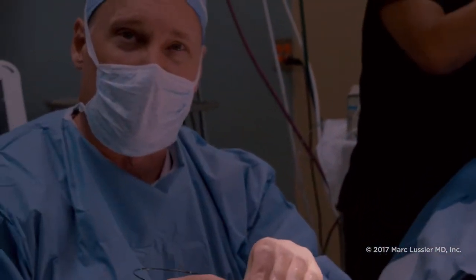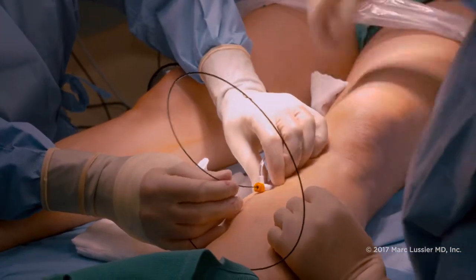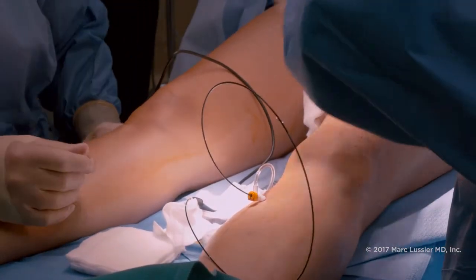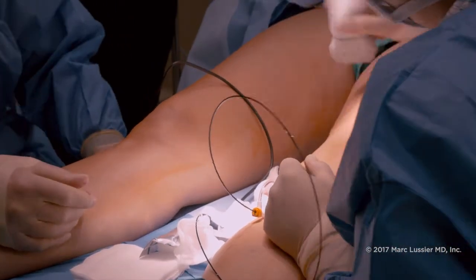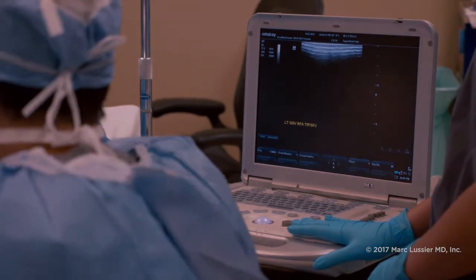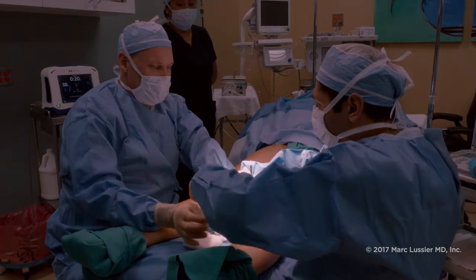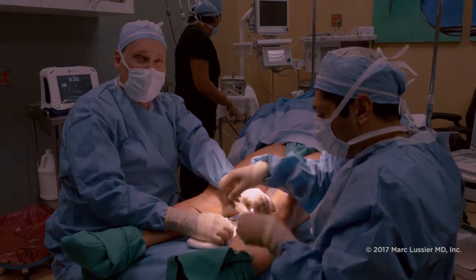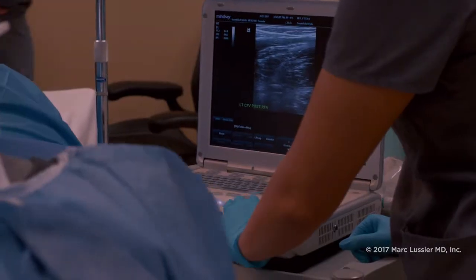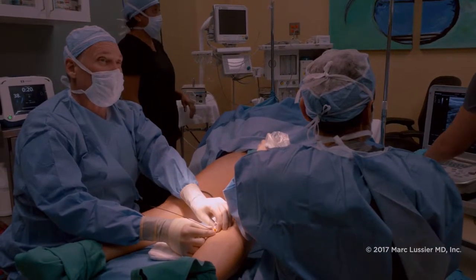We'll follow along using ultrasonography to see how we're doing passing this into the vascular system. The catheter is now inside the vein and Surin is following along — we're looking on the computer screen to see where the catheter is passing, and you can see it easily. We've passed the catheter up to where the deep venous system joins the superficial venous system, and we've pulled back. Next, we're going to start numbing up the vein to protect the skin and make it more comfortable for the patient.